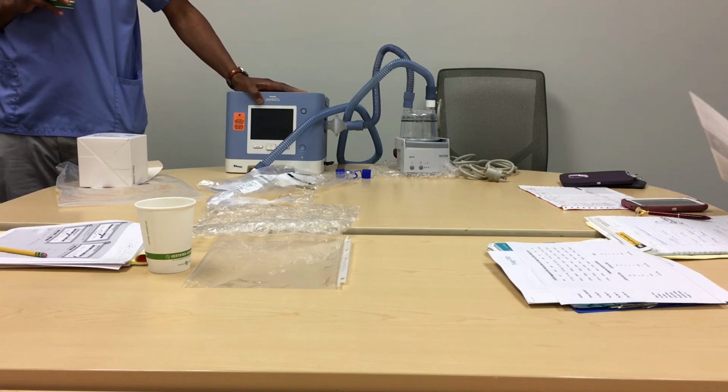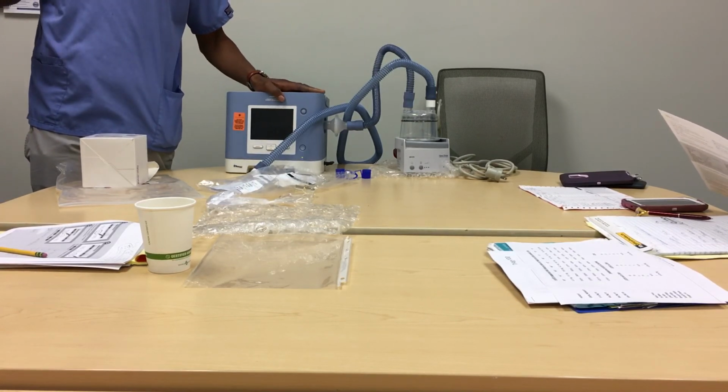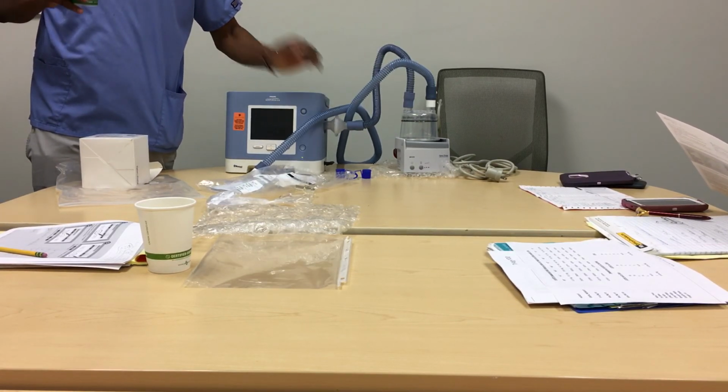So with an E cylinder, somebody on 2-3 liters, how long is that going to last? 4 hours. Okay, that's decent. Yeah, but you put them at risk of running out of oxygen. So it's more closer to 5 hours at 2 liters. Good for a trip to the grocery store and back? No, it depends on how they fill up that cylinder. If I remember right, 4 hours, it was 2200 or something, but it would be 5 hours.